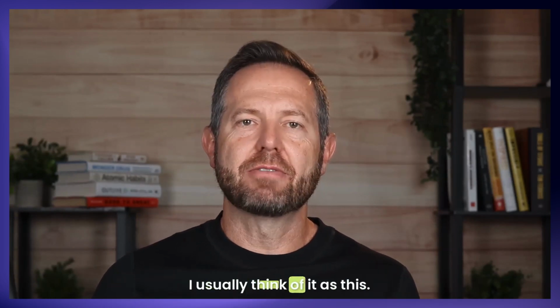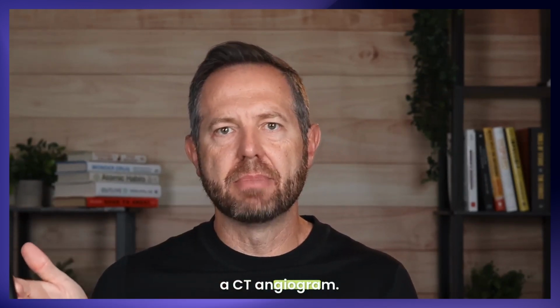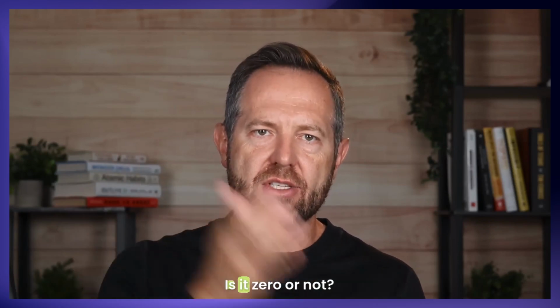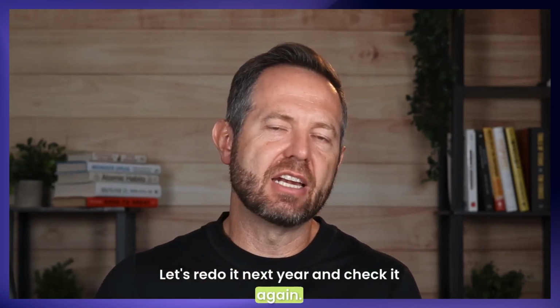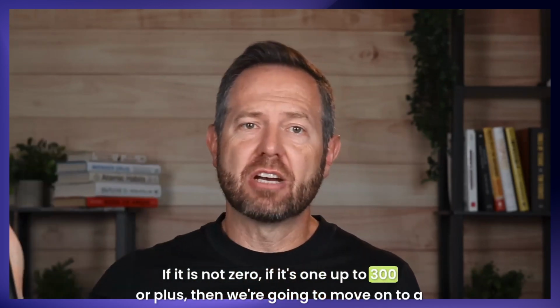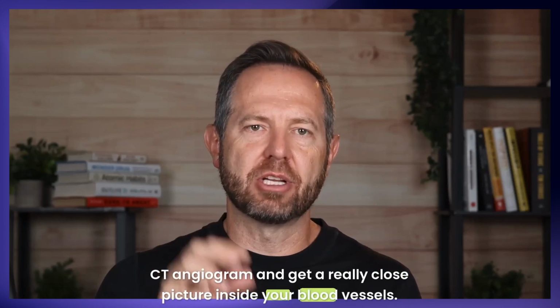I usually think of it as this. If you're going to do a calcium score and it's not 0, then you should move on to a CT angiogram. So the calcium score really becomes yes, no. Is it 0 or not? If it's 0, then cool, let's wait, let's redo it next year and check it again. If it is not 0, if it's 1 up to 300 or plus, then we're going to move on to a CT angiogram and get a really close picture inside your blood vessels.